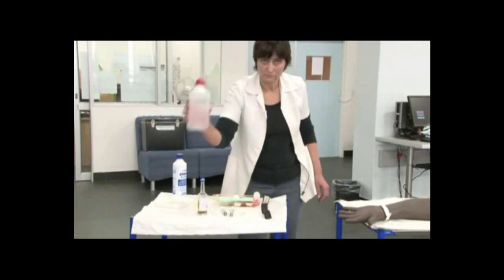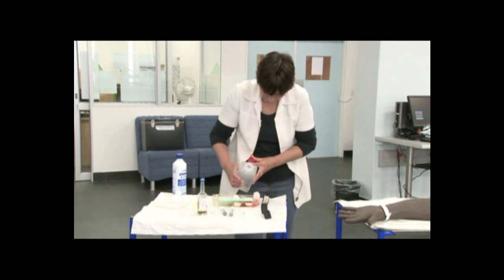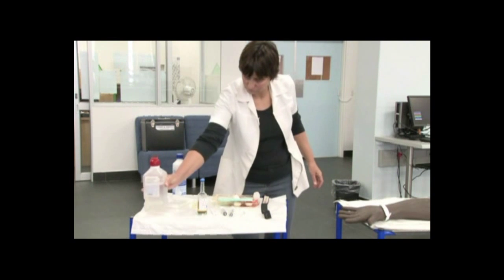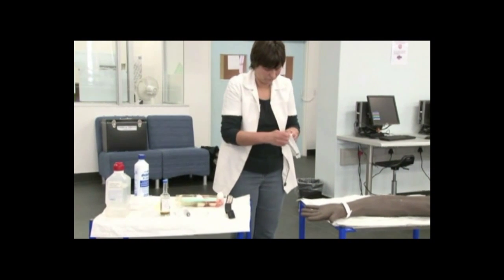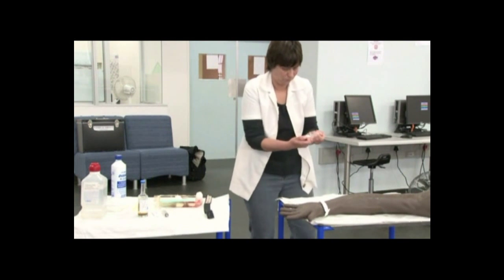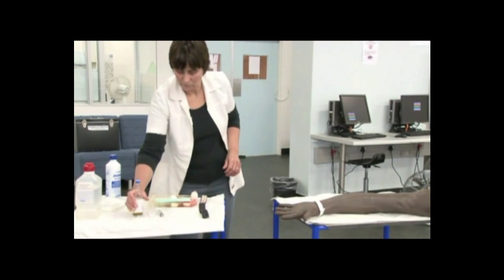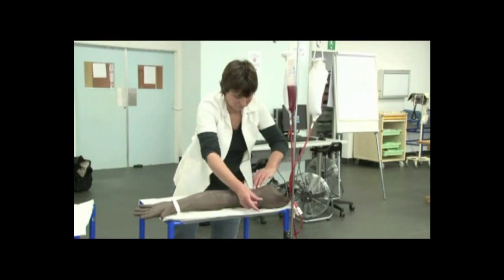Pour the povidone iodine or the appropriate cleaning solution into the fluid recess located on the blood culture pack. Drop the needle and syringe onto the sterile field. Flip the plastic top off the culture bottle, being careful not to touch the injection port. Apply the tourniquet and select a suitable vein.